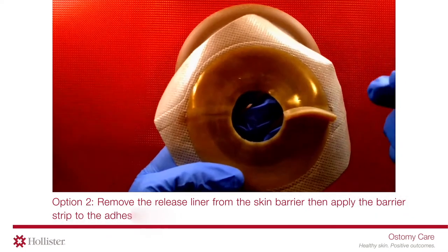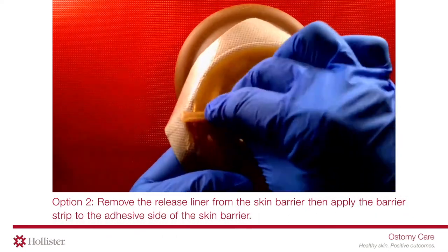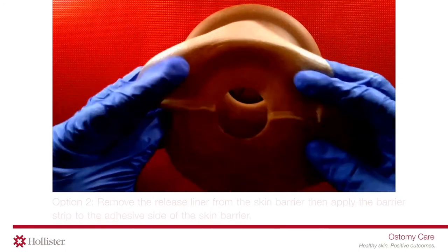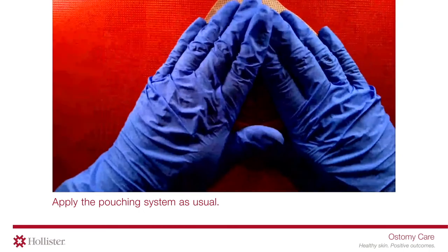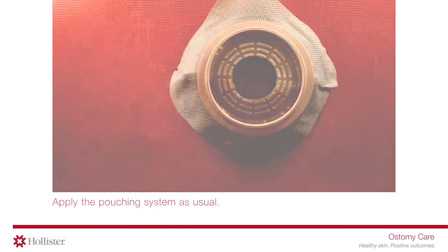Option two: remove the release liner from the skin barrier, then apply the barrier strip to the adhesive side of the skin barrier. Apply the pouching system as usual.